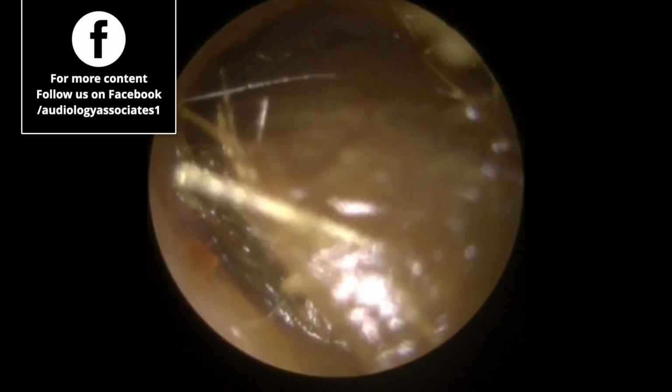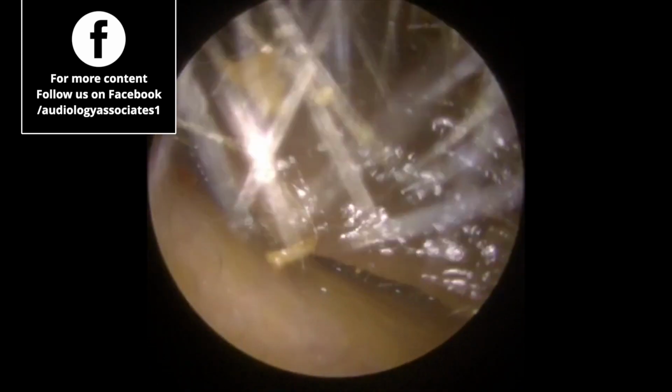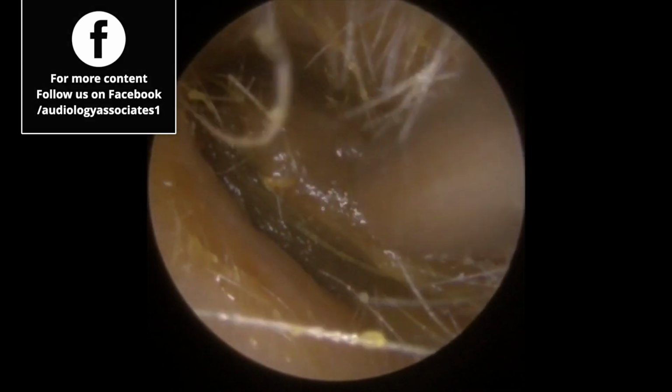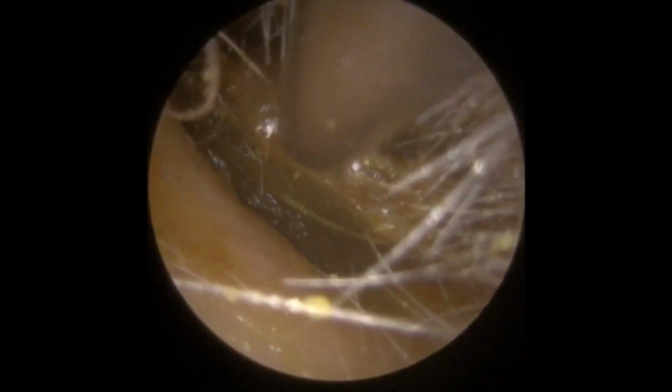So this is the second ear. Quite a large dry chunk of wax in here as well. So just trying to get a good look at it, make sure there's nothing too untoward going on here, but it looks perfectly fine. So we're just going to lift the side away first of all.